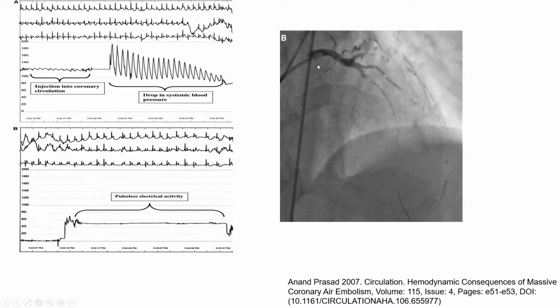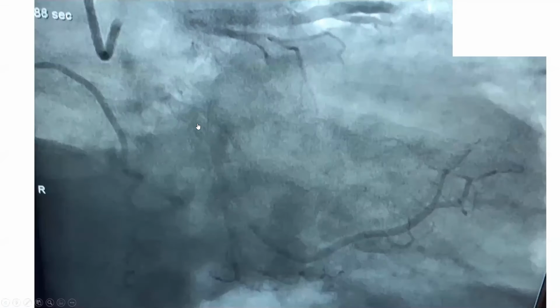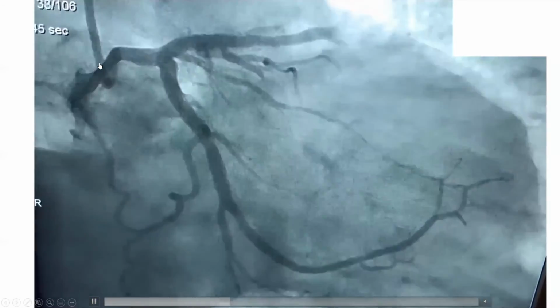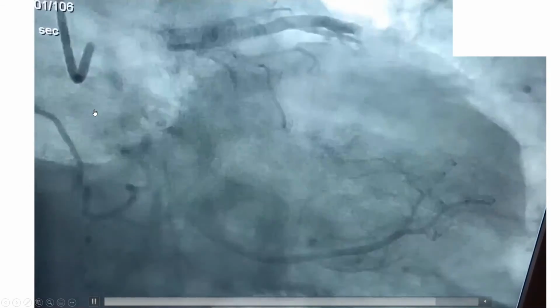This is a case reported here where you see the catheter damping before you inject contrast. And that's another hint that the operator here did not recognize. You don't just see air. If you're careful, you will see air, and that will caution you to not inject. That's one way to prevent it, besides the proper flushing. You see air.